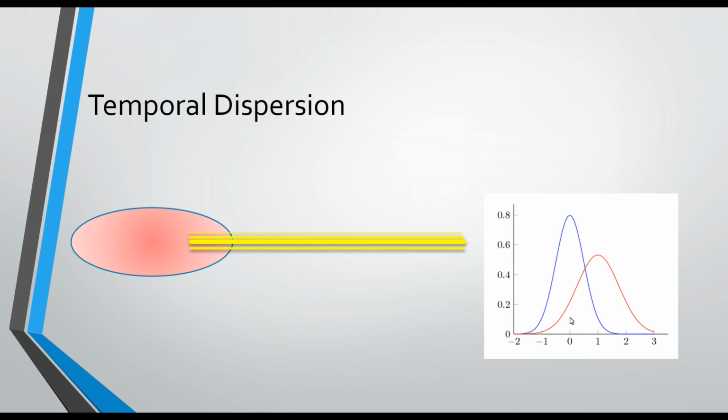When one has a demyelinating process, those processes are often quite patchy. Some nerves are affected more than others, particularly more myelinated ones are going to take more of a hit, and so the clustering of the individual conduction velocities will start to splay out. That's temporal dispersion.